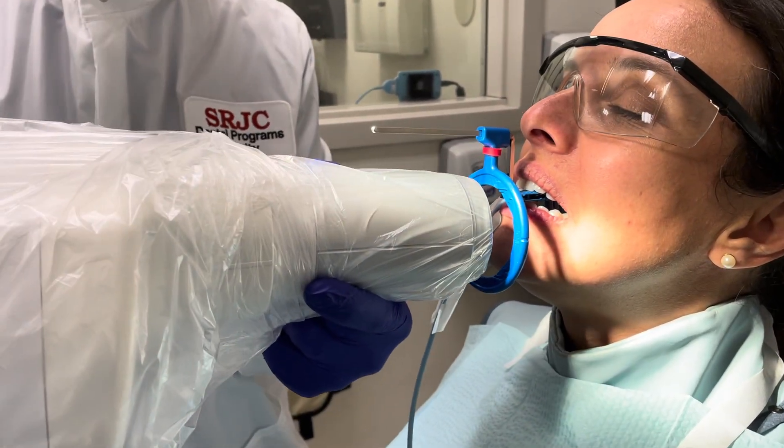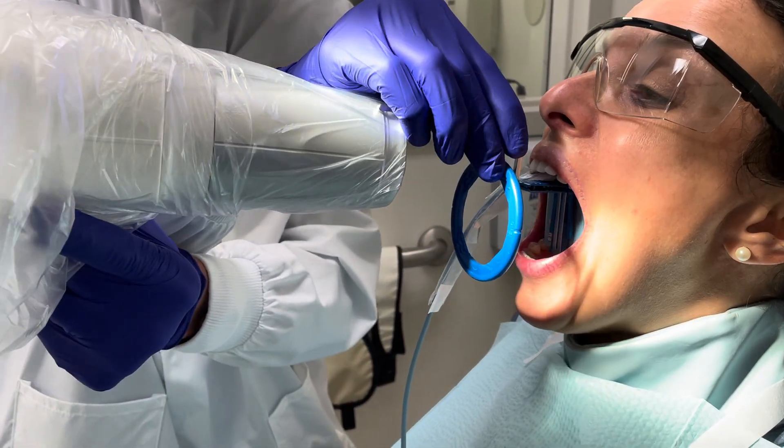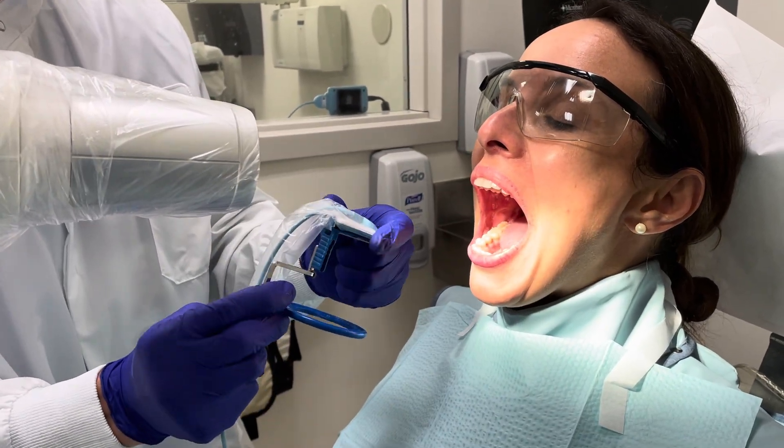And then we line up. Perfect. Open please, Maria. The next one — same idea when we're doing the canine — we'll do the left canine.